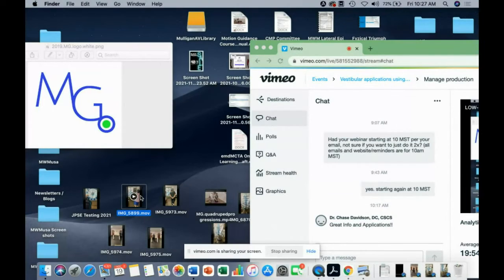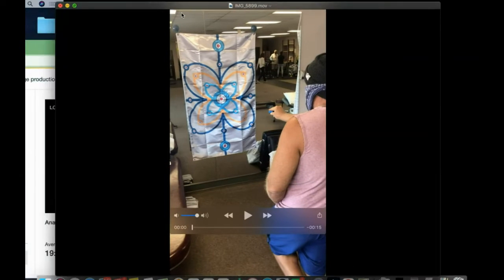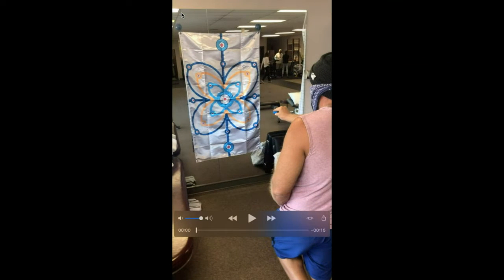Other actions that you could piggyback off of with this would be adding in some dual tasking. So we're going to change the laser in this case from being on his head to being in his arm. So he's going to go through more complex movement patterns, some more peripheral cerebellar activity by going through some arcing motions with his arm. I have him in narrow base of support, so this is further progression. And then he's going to dual task by doing a toss and catch with the left hand. This is definitely going to be very tough, but this is progression over a few weeks for him.